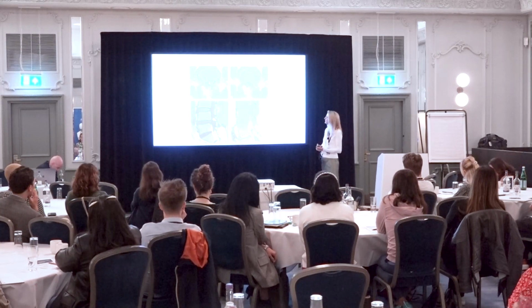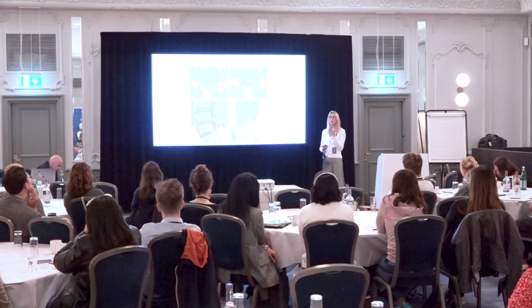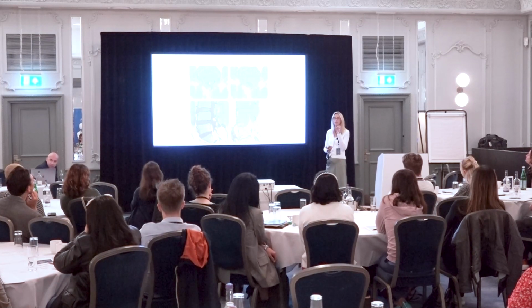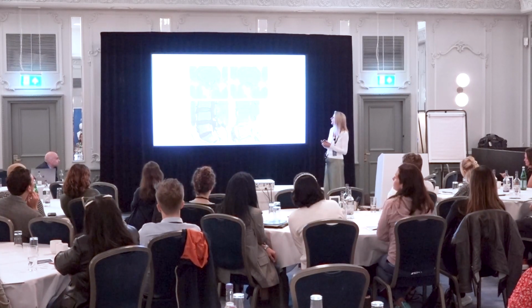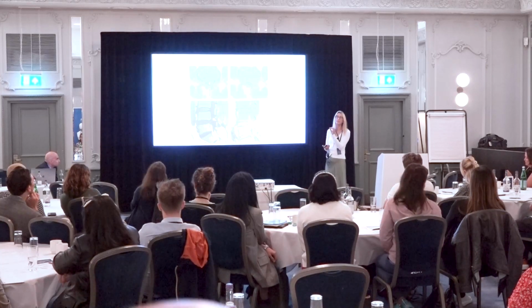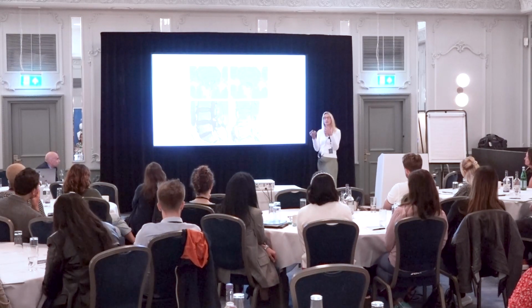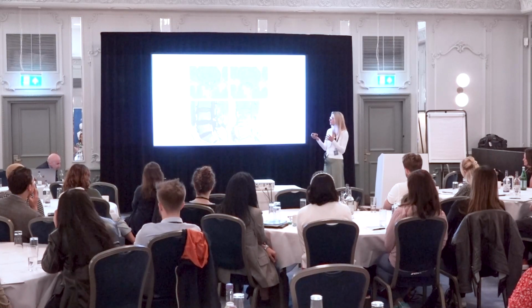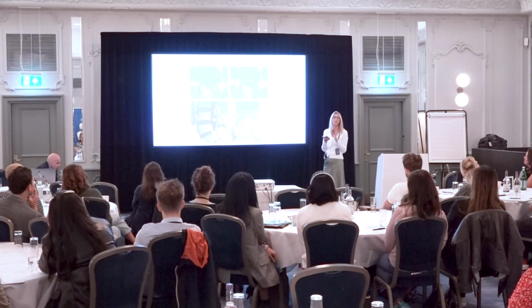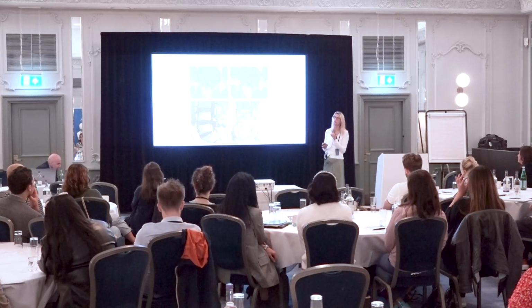Now, in the very early phase at the operative site, no matter how delicately and with precision the surgeon's been, the scan will often look a bit alarming. That's very, very common. No matter whether it's a tiny fenestration and it's been a very targeted approach, the initial scan within 6 hours can look bad, a bit like pituitary surgery. It can look really bad, but it isn't bad at all. It's just the body reacting. And it's important not to overcall.